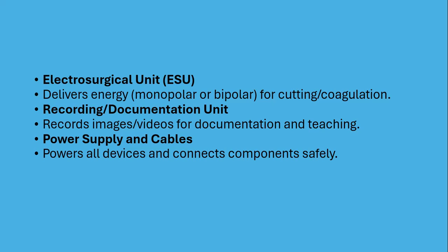Recording/documentation unit: records images and videos for documentation and teaching. Power supply and cables: powers all devices and connects components safely.